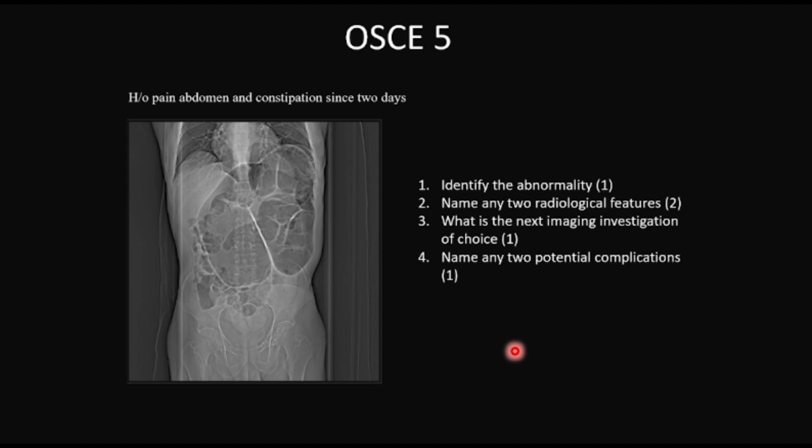Next investigation of choice is CT abdomen, and 2 potential complications would be obstruction, perforation, and also bowel ischemia is one of the complications.